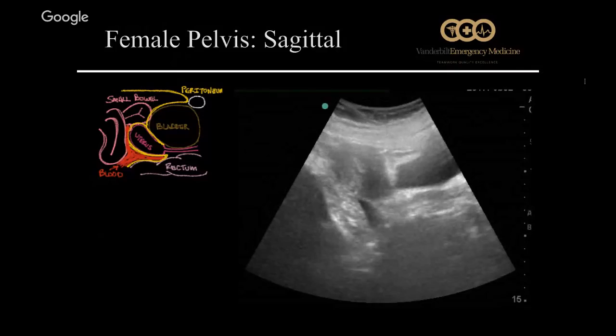Here's another example. Top right's the bladder. Scanning through, we see the vaginal stripe, uterus to the left of the bladder, and then adjacent to the cervix, we see a collection of free fluid. Now you can confirm in the transverse, and I usually do.